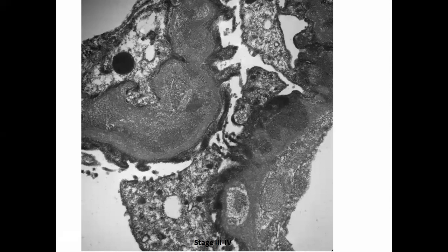So the advanced membranous. So as I mentioned, stage 3, 4 membranous here. The advanced membranous is going to show, just see the thickness of the GBM. The GBM increases in thickness. There will be some dark deposits, and majority of the deposits will be electron lucent. They will not be electron dense.